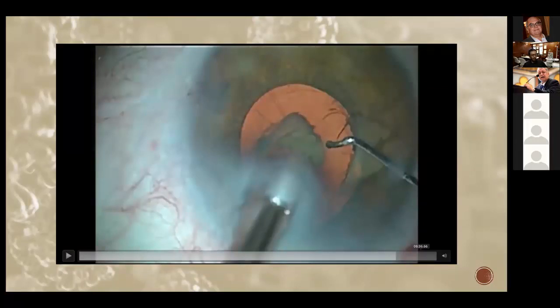That's an excellent attempt. I have a small comment to Dr. Wael: removing the lens and reintroducing it will allow the anterior chamber to be opened through a large incision, which will induce much astigmatism. This is the first part. And the second is that while you are maneuvering the leading haptic and the trailing haptic through a large incision, you almost always end with some hypotony and distortion in the visibility, which makes the procedure more difficult. Dr. Yahya managed the case perfectly.